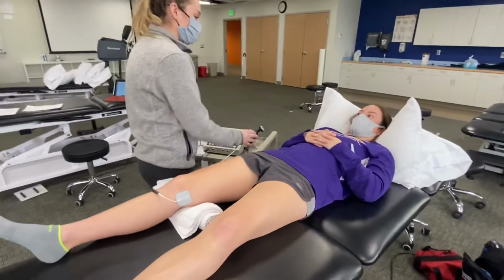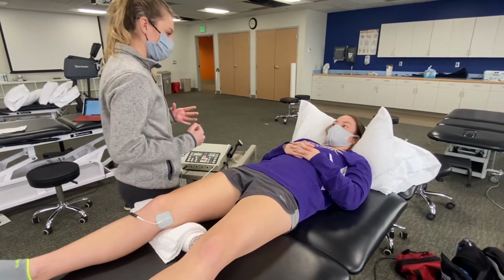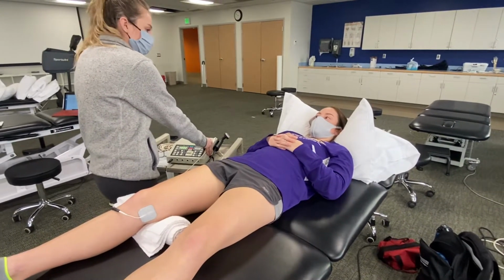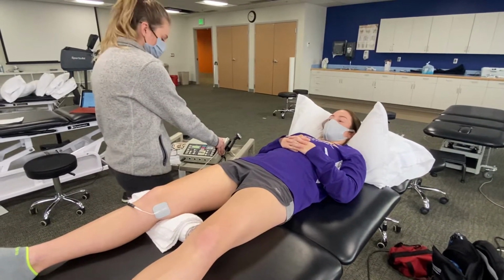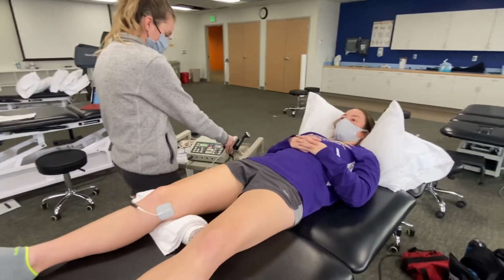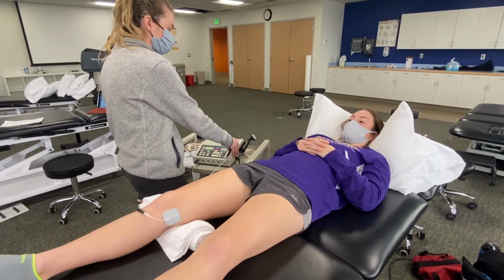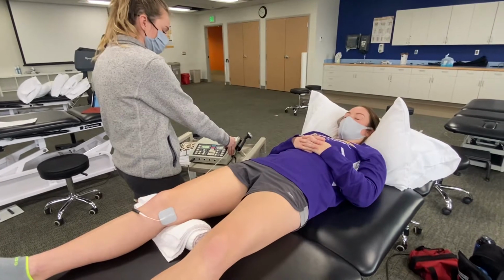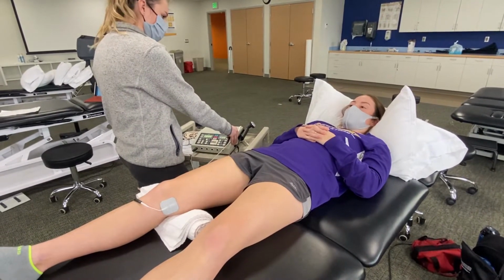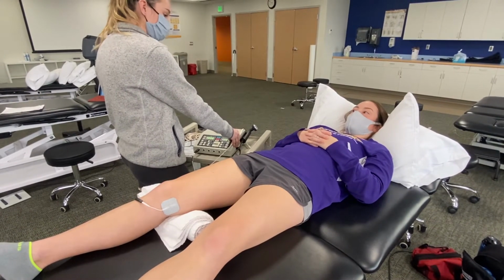Okay, so I'm going to start increasing this. This should be very comfortable, like I said, and we describe it as a strong tingle. So you just let me know when you'd like me to stop, okay? When you start feeling it, just tell me, and then I'll start to go slower. Okay. I'm starting to feel it a little bit. I'll go slower here, and you just tell me when it feels like a strong tingle. You can keep going. Okay, right there. Right there? Mm-hmm. Okay.